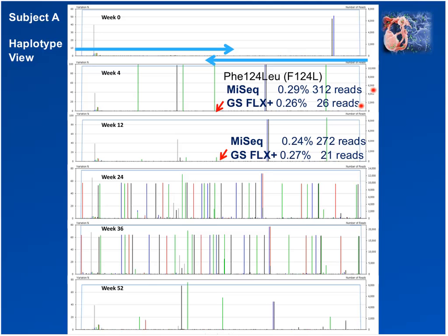When the number of reads drops below 50 representing a variant, some people may start to get uncomfortable about whether that number of reads can be trusted. But as soon as you get up into the hundreds of reads, it does bring a lot of confidence along with any variant frequency determination.